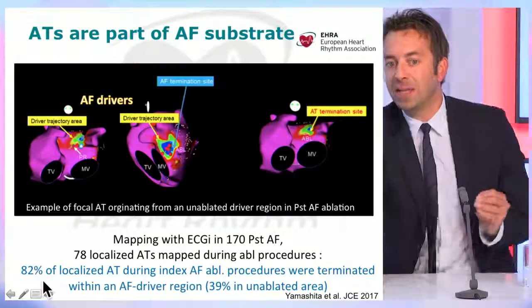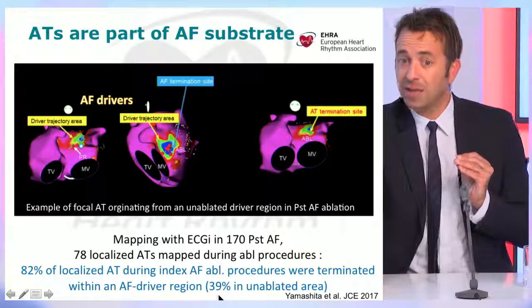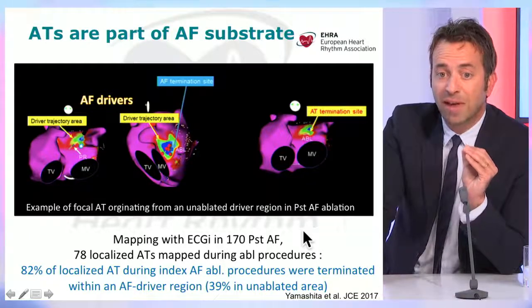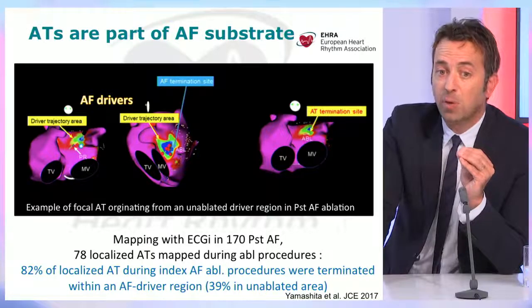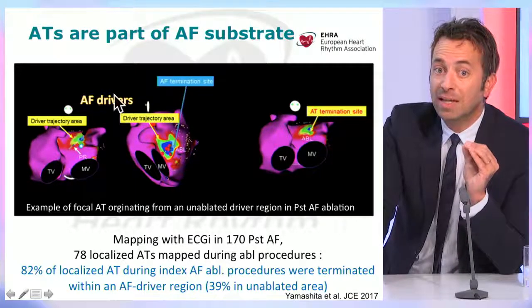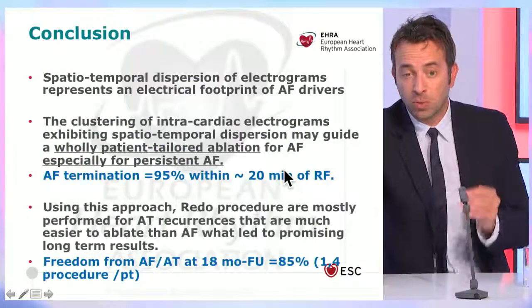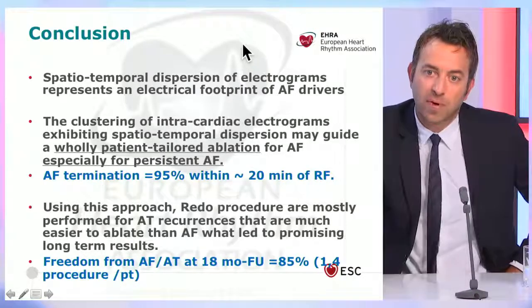So they observed the same results in a large cohort of patients. 82% of the localized ATs they observed were terminated within an AFib driver region, and 39% in unablated area. I think these data are very important, and I have to tell you that we have exactly the same results in a publication that is not completed, but we have, with a different way of mapping, exactly the same results. So, in my opinion, ATs are usually not induced by ablation, but unmasked by ablation and are part of the AFib substrate. So, to conclude, dear colleagues, spatio-temporal dispersion of electrograms represents an electrical footprint of AFib drivers.